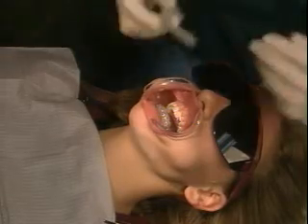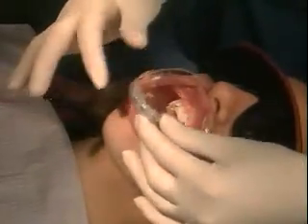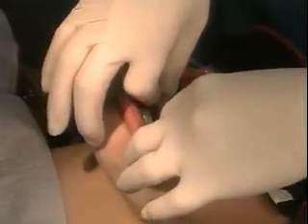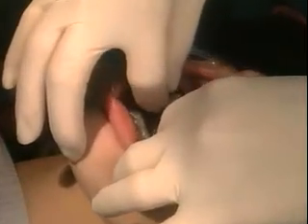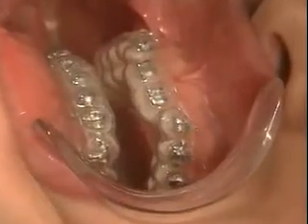Seat the upper tray with a hinge motion. Note the firm pressure occlusally, labially, and buccally to avoid tray rotation. Hold the tray firmly for a minimum of 30 seconds using a timer. After the 30-second hold time, let the tray sit for 2 minutes.